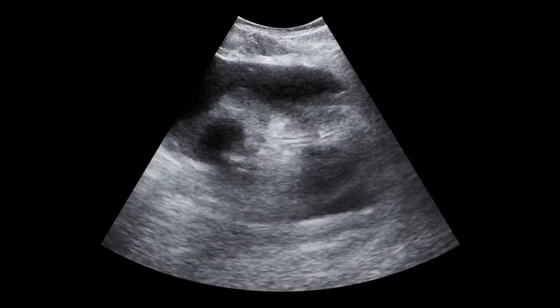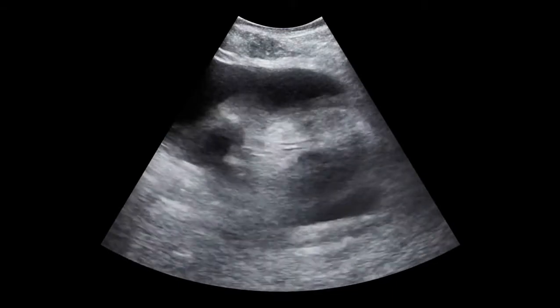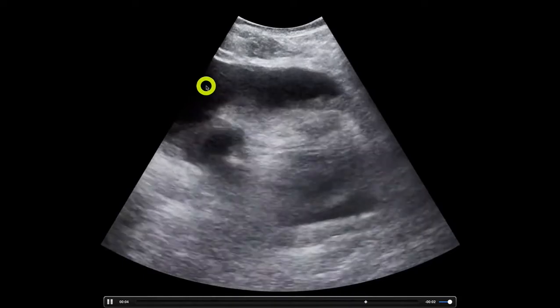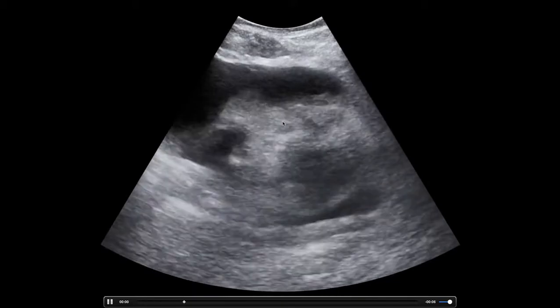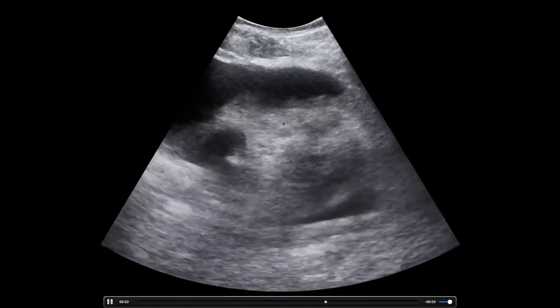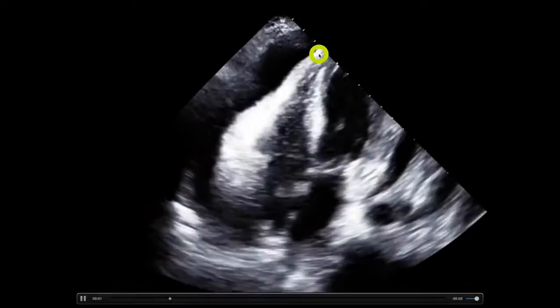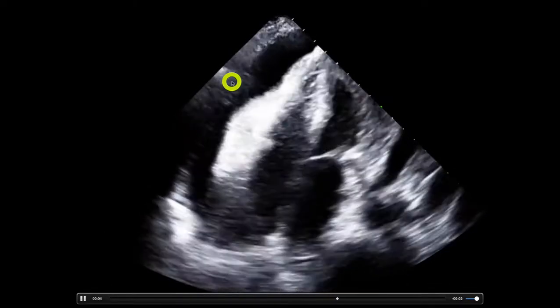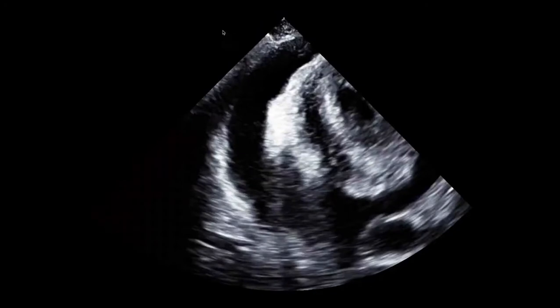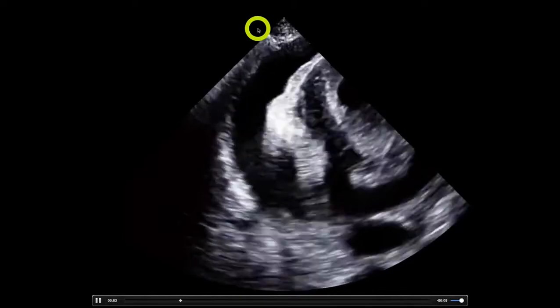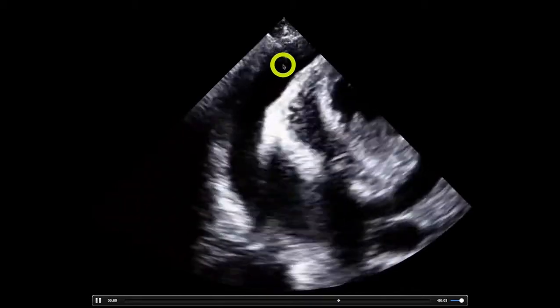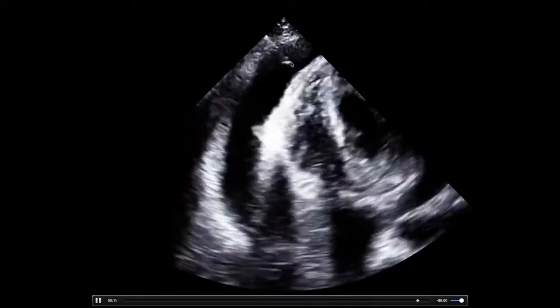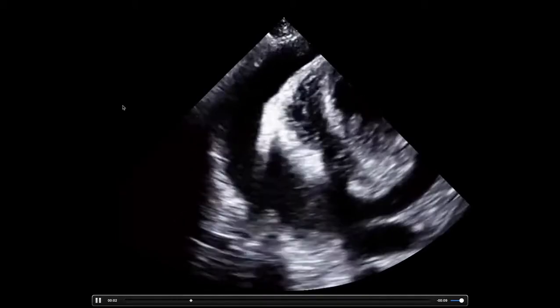Now let's look at some images. This patient presents hypotensive with a fairly significant pericardial effusion — you can barely even see the right ventricle. When the right ventricle is this compressed, especially in a hypotensive patient, there's a good chance they have tamponade. In the next image, there's a pretty big pocket that's easier to access. Watch here — you'll see the needle enter and pop into the pericardium right there. You can see the needle tip successfully entering the pericardial space.